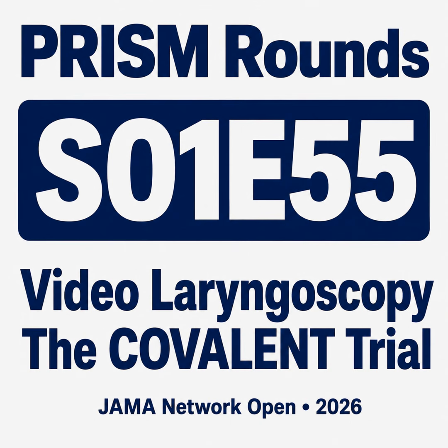Exactly. You'd open the mouth, sweep the tongue, and look directly down the barrel of the human anatomy to find the vocal cords. Which takes a lot of practice, by the way. Oh, an incredible amount of muscle memory. But today, though, you are far more likely to grab a high-definition camera. Video laryngoscopy has aggressively taken over airway management. It really has. Everywhere. Yeah, if you're standing at the bedside of a crashing patient in the intensive care unit or the emergency department, that video screen is usually the absolute first thing you turn on.